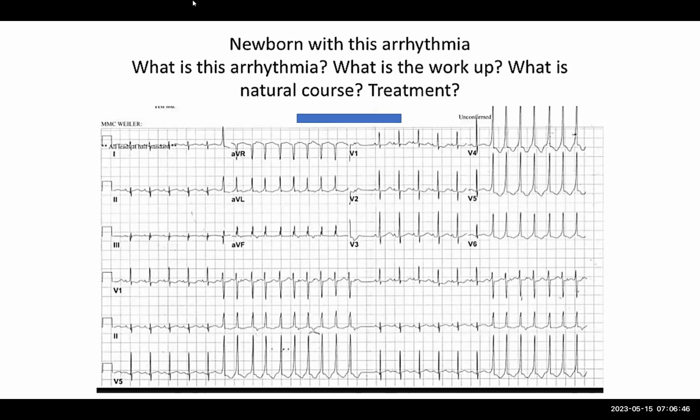There are these reports, mostly out of Texas, of people who have Purkinje cell tumors, particularly in the left ventricle. This seems not to be left ventricular in origin, but definitely you would want to look to make sure you don't see that. Although quite frankly, I've never seen that, but it is certainly well described. Okay, so the echo looks basically normal.